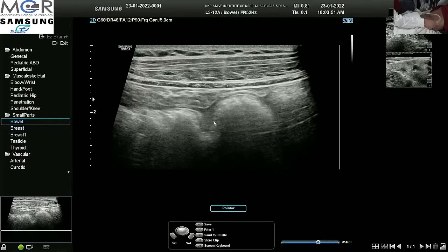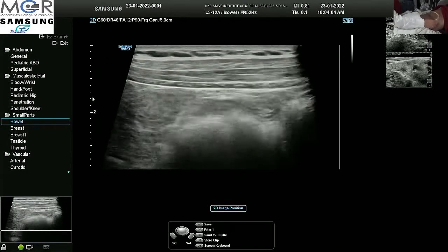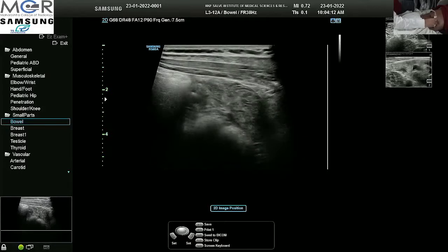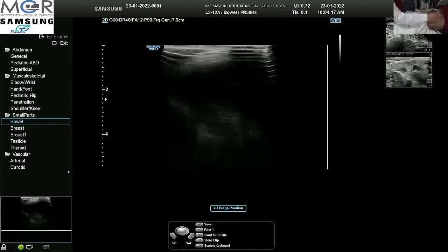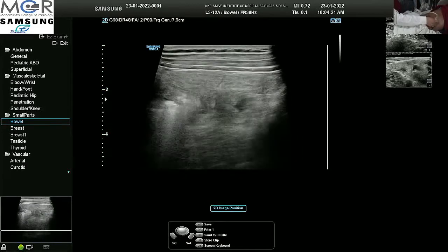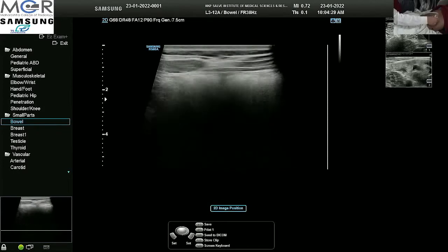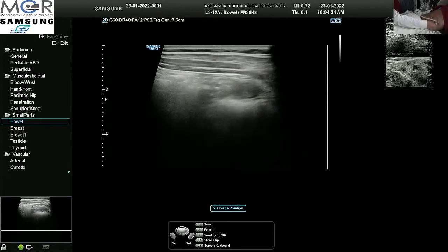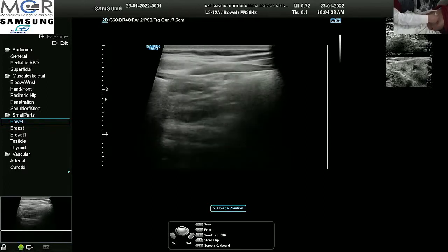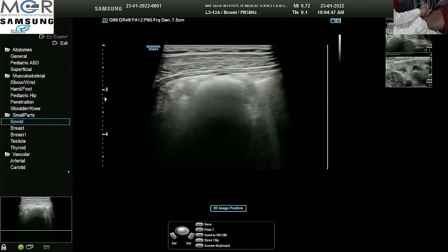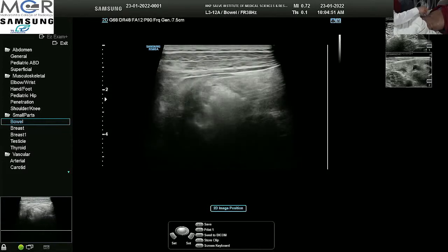These thicker ones are the haustra and they are further apart — if we remember the valvulae conniventes in the small bowel, they were close by, but here the haustra are thicker and further apart. I am tracing the splenic flexure of the colon, which may be hidden in the left hypochondrium and may not always be visible — we can take the help of a convex probe. Here is the transverse colon. Coming from the descending colon and then the transverse colon, everything is given away by the gas. I trace the transverse colon up to the hepatic flexure and then downwards into the ascending colon, going down to the level of the cecum.